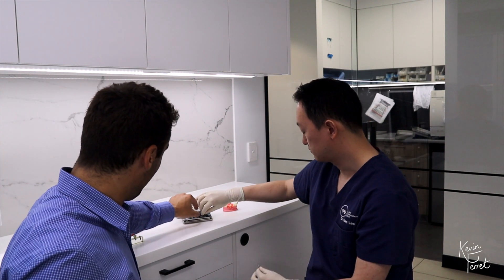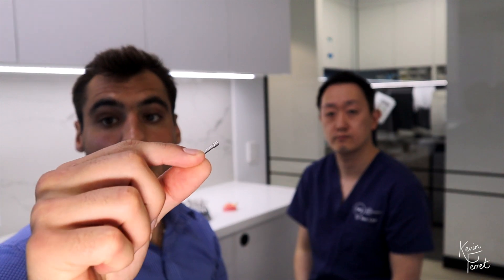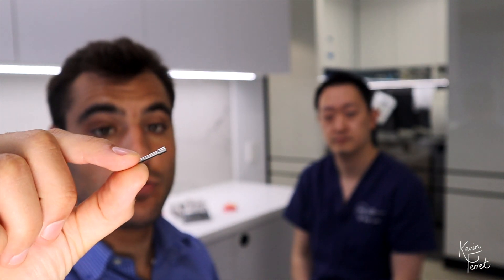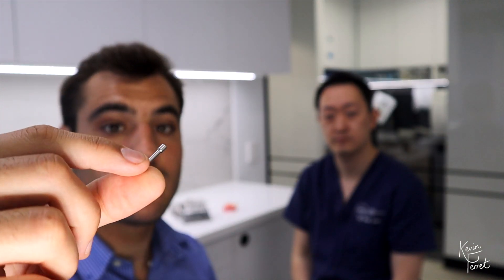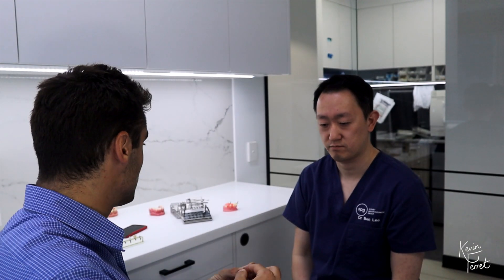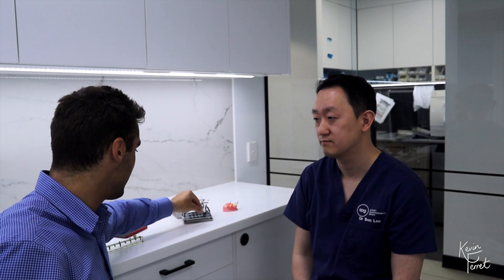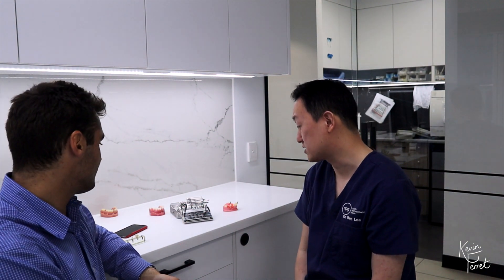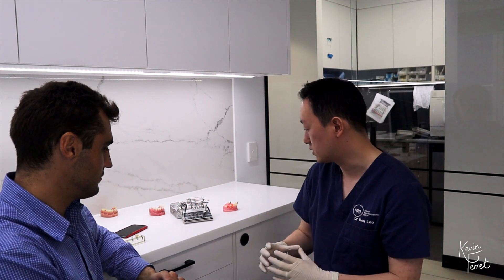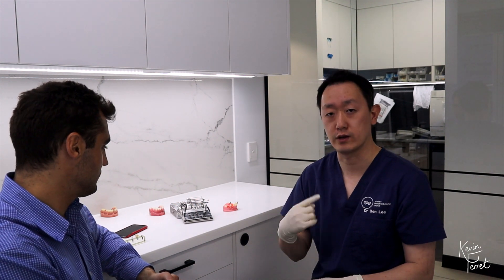The last driver in the PureSet Kit is the multi-unit driver. You recognize it because it is plain — there is no mark on it — and it has a hexagon shape inside. As the name suggests, it is for multi-unit abutments. It looks very similar to the ON-1 driver, which is why the key distinction is: the ON-1 driver has a black ring, whereas the multi-unit driver does not have the black ring.